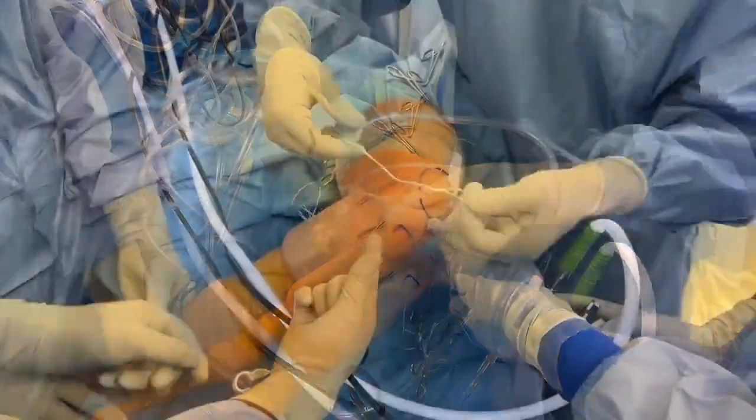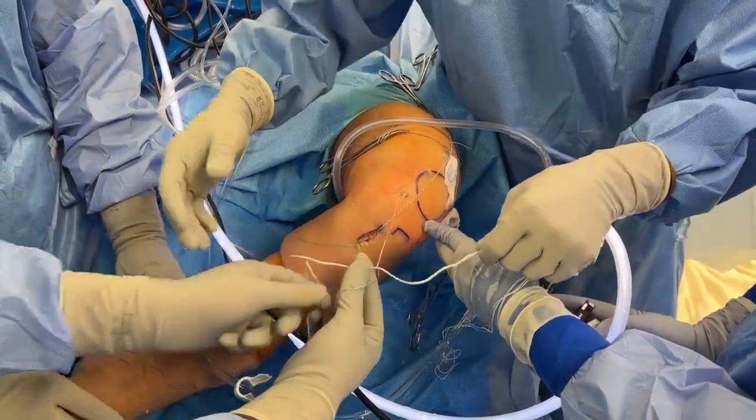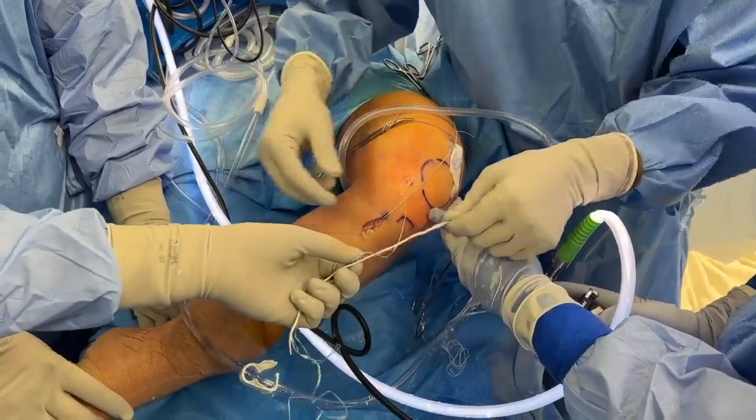The suture lock implant is unpackaged and the distal end is loaded into the fiber-linked passing suture and shuttled retrograde through the inferior medial portal into the trans-tibial tunnel.